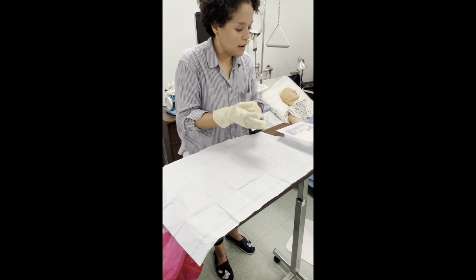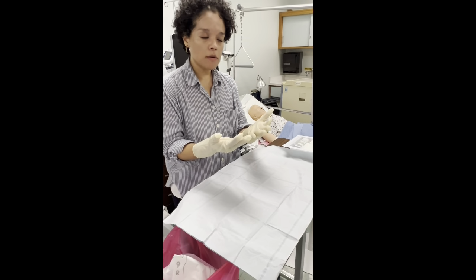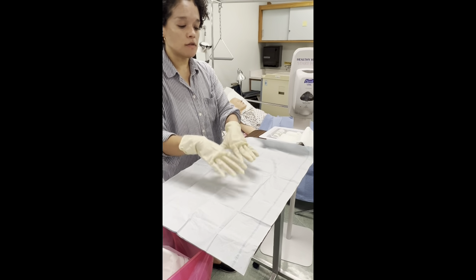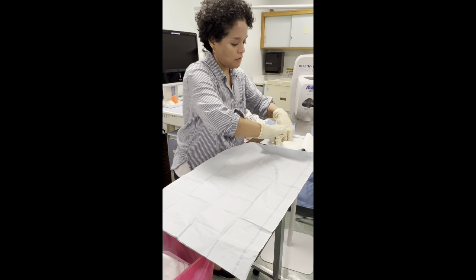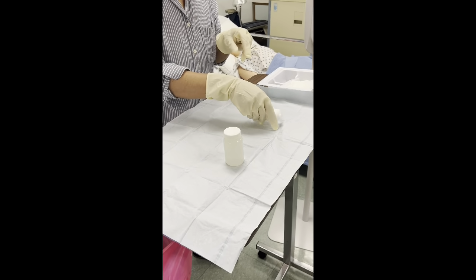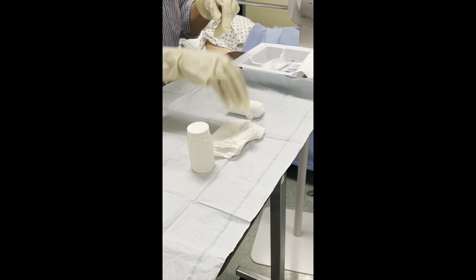Good. Okay. So as you have your sterile gloves and your sterile pad and your field is created, you're going to remove the kit contents onto the pad here. So that includes the solution, a roll of gauze, another pair of gloves, just in case.